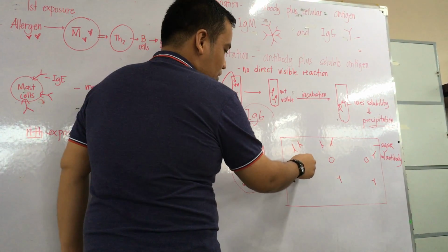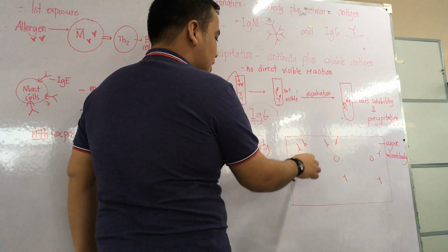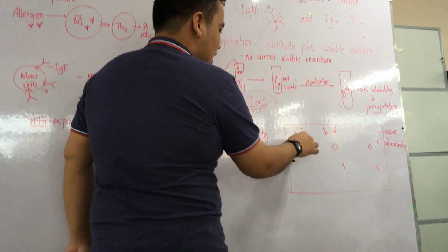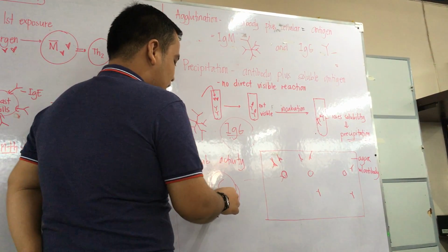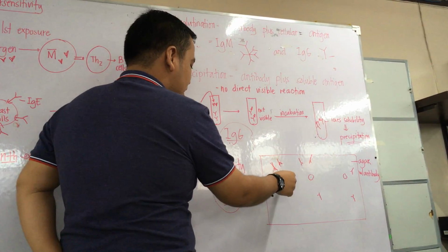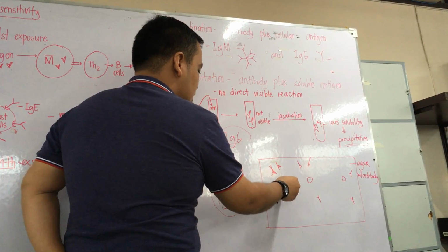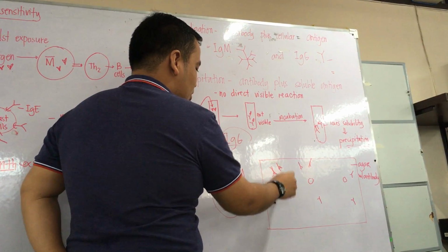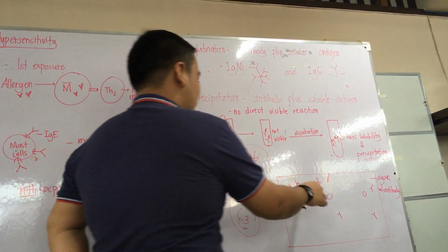Once you will place it on the well, since it is surrounded by antibody to C3, what happens? Antibodies are stuck within the agar. They will not move. It's the antigen that will move towards the antibody. So try to imagine C3 going here, C3 going there, and basically in all directions because they are surrounded by the antibody.